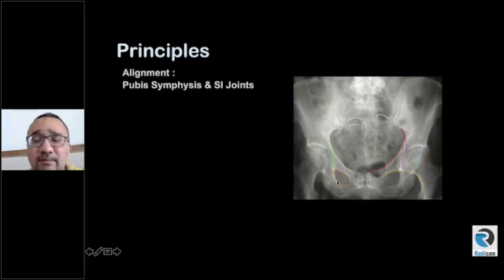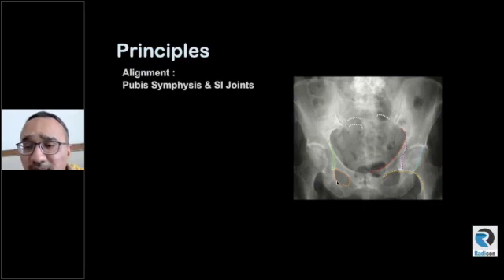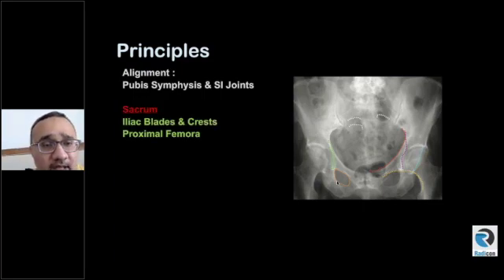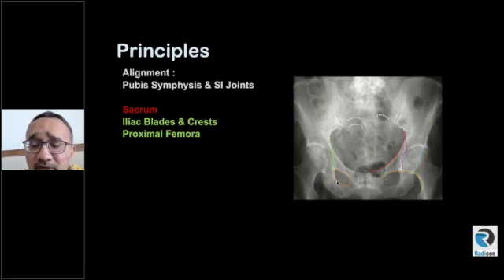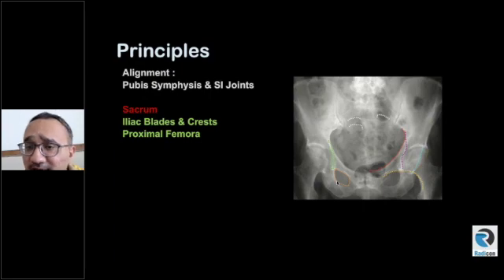These are important tips and landmarks to help us identify any subtle abnormality. When you look at the sacroiliac joints, don't forget the sacrum — the sacrum is a review area. Pathologies can hide in the sacrum; there could be overlying bowel, but always look at both sides of the sacrum to check for any asymmetry or lesion. Moving laterally, go to the iliac blades and iliac crest, because things can also get hidden there.